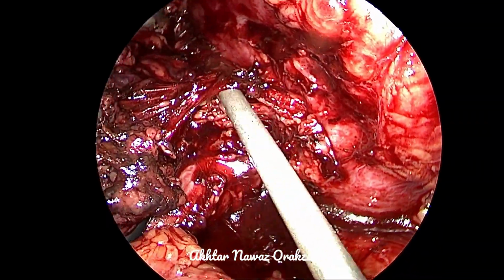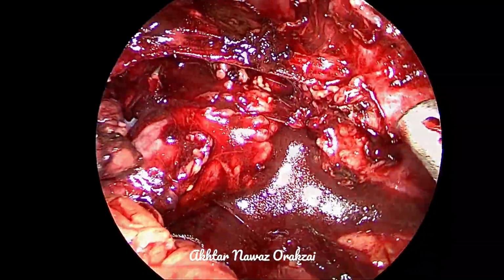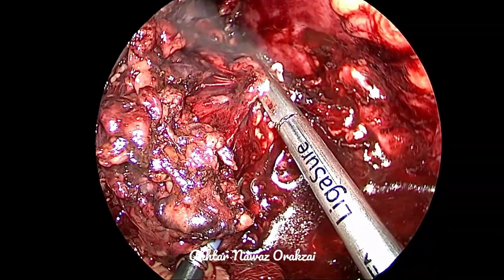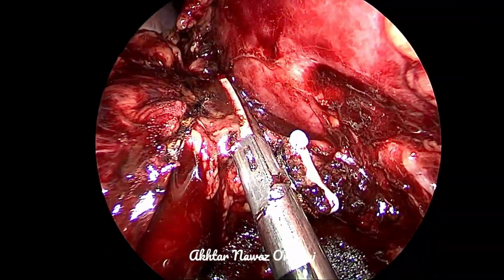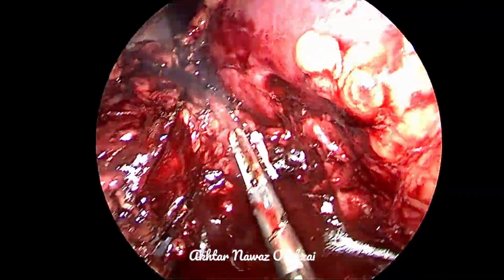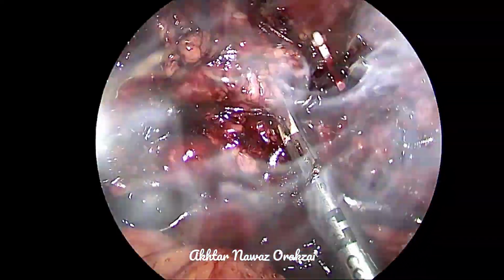Here you can see that the small artery is coming. This one is the artery which is coming from the renal artery. So we clip it away from the renal artery, and then we burn it with the ligashore, a vessel sealer, and then we divide it. So some blood supply to the adrenal is now cut off, and we expect that the bleeding and the ooze and the congestion in the adrenal gland will now decrease slowly and gradually.